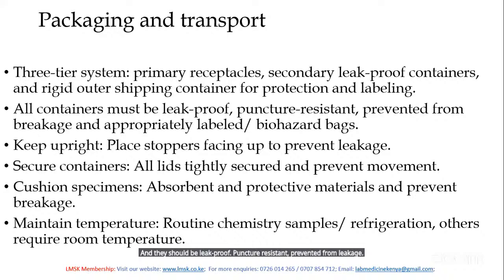And as I said, label them appropriately. Keep upright, secure the containers, cushion the specimen, and you maintain the required temperature.